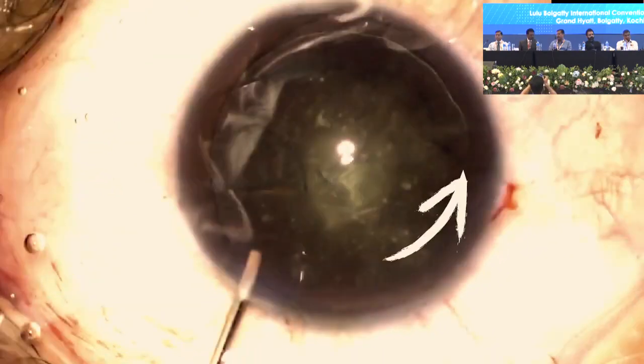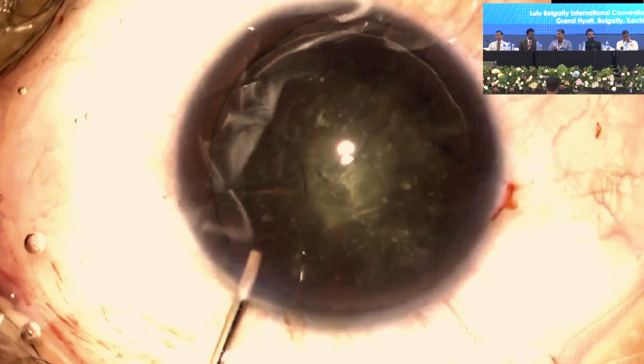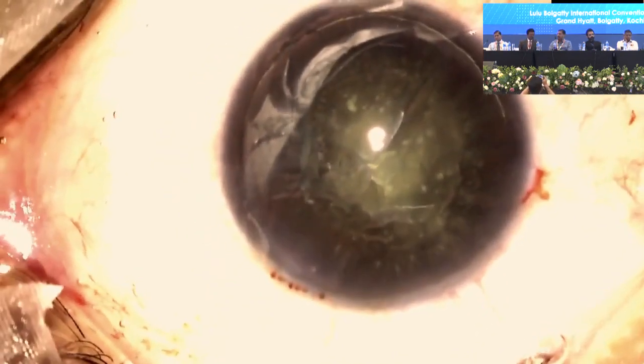Perhaps there might have been a tiny tear. Perhaps there might have been an accidental nick in the anterior capsule during the last step of going back in, hooking onto the rhexis and bringing it inwards to complete it. After introducing some viscoelastic, I attempt to perform a phaco.